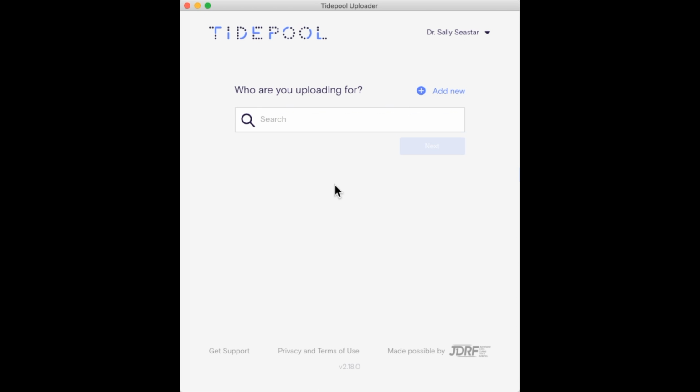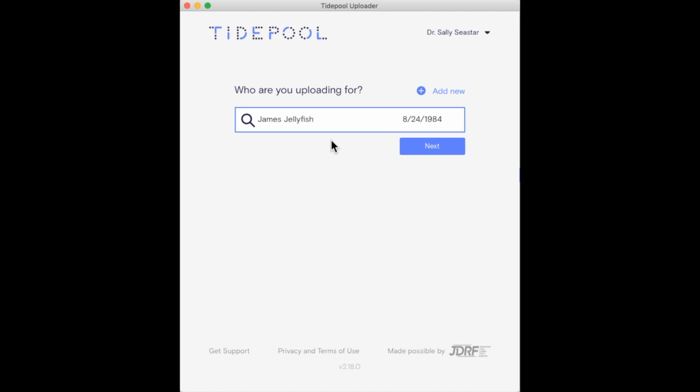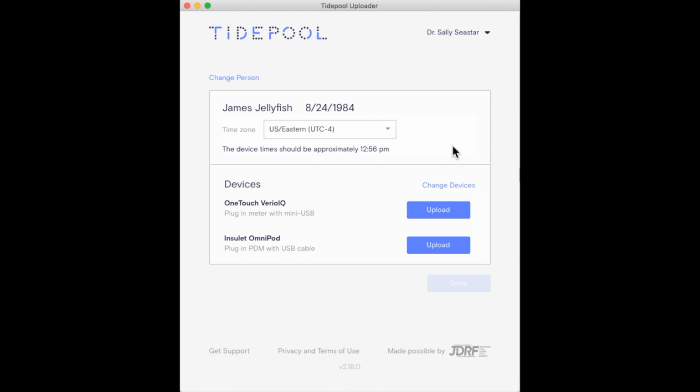To upload data to your patient's account, first we start with our friendly search bar and search for a given patient's name. We'll go to James Jellyfish for the rest of this demonstration. And here there are a couple of things to keep in mind. One is the time zone.